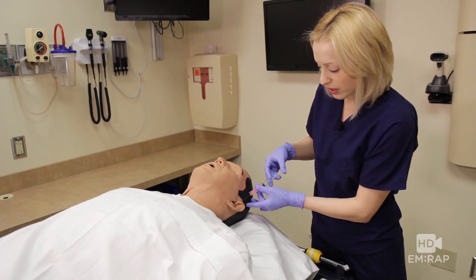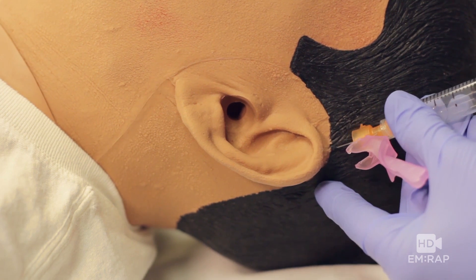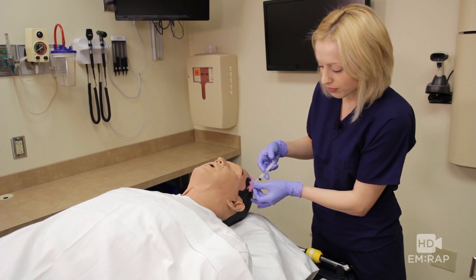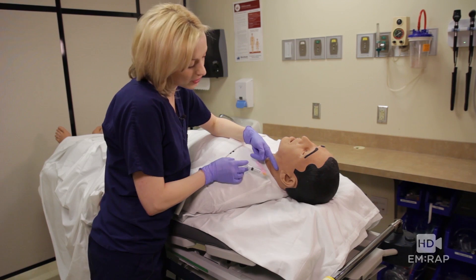Now we're going to redirect our needle posteriorly, just like a ring block. Aspirate as you advance and inject as you withdraw. Now let's go to the other side and we're going to inject inferior to the ear.